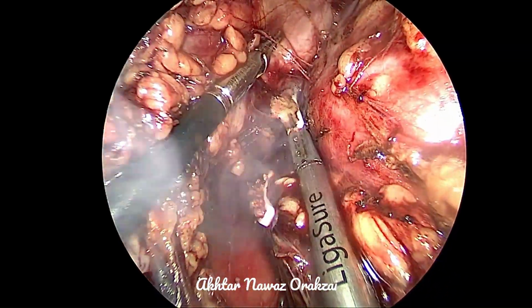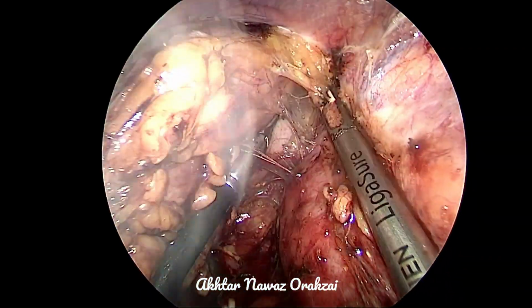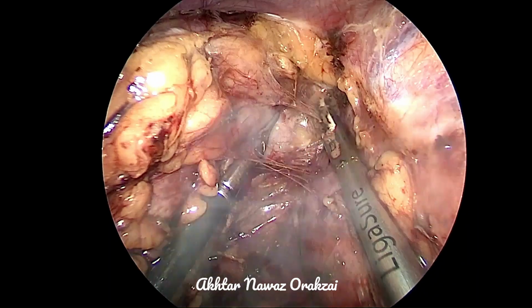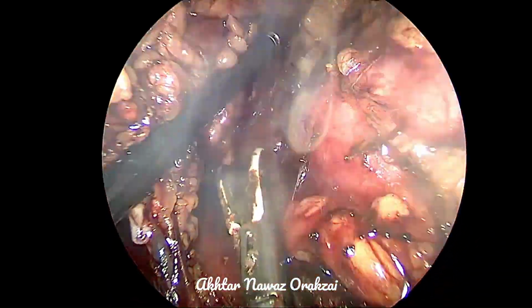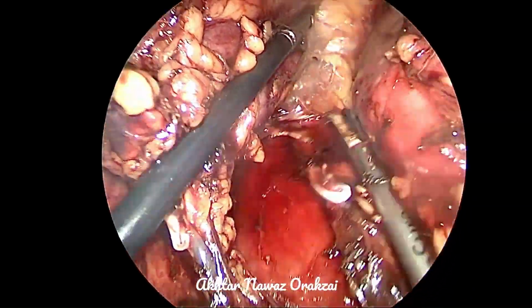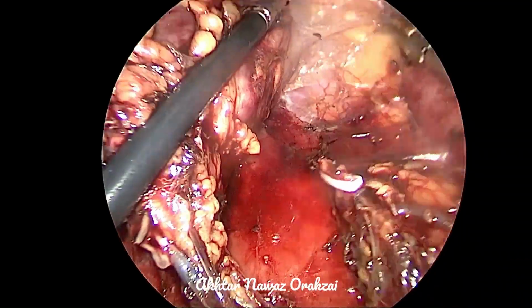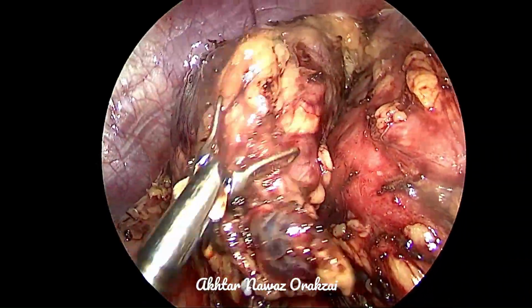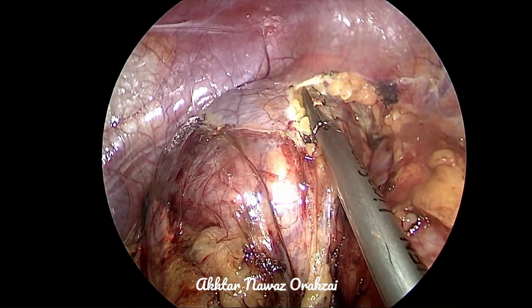Now we are sure that there are no vessels anymore that exchange between the kidney and the adrenal gland. So our dissection is more bold, and we can see very clearly that the adrenal gland is completely separated from the kidney.